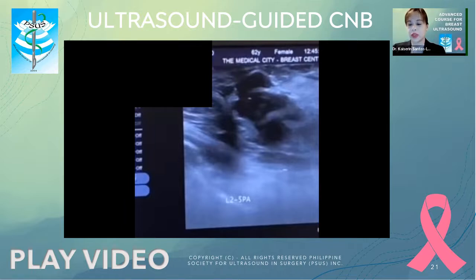As your needle enters the breast tissue, as you approach your target lesion, and as you fire to get sample tissues, we must maintain the needle parallel to the chest wall at all times, and keep the target lesion at the center of your screen, to continue to visualize the entire needle as it goes through the lesion as well as the surrounding tissue.